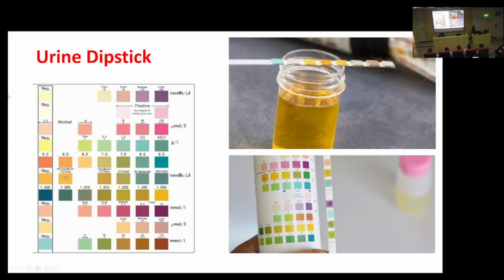So imagine this is your urine dipstick, and each of those squares is basically a different membrane with different properties that will detect something different. So this could be pH. It will tell you if the urine is acidic or alkaline, and you will be able to know by the change in color. What color did it change into once you dipped it into the urine?